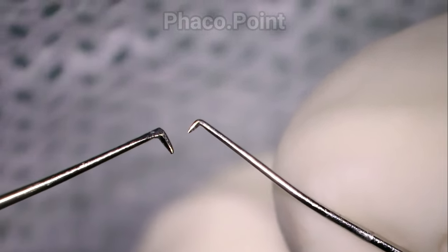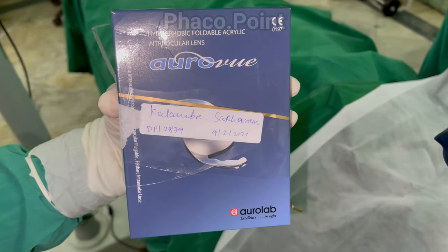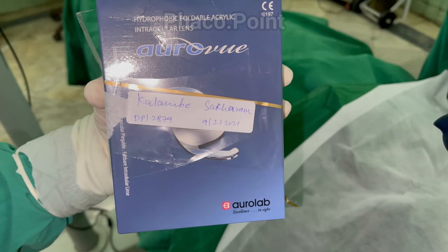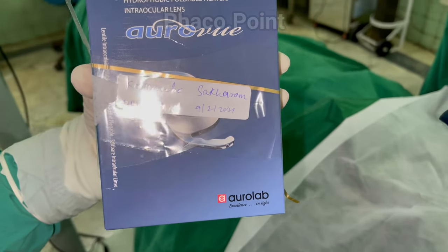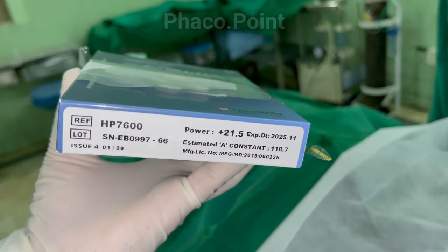Finally, last but not least: check the IOL and confirm that it is the correct one for this patient — verifying the IOL company, the IOL design, and the IOL power.